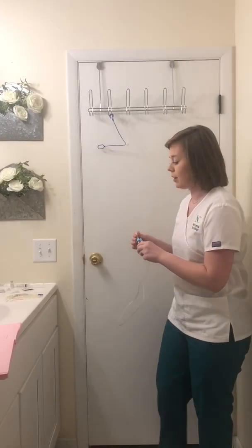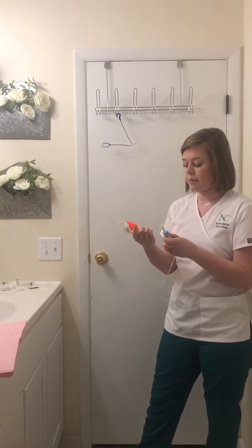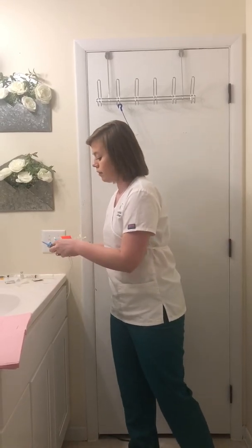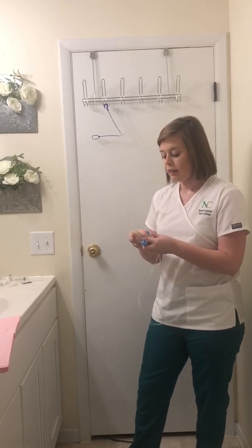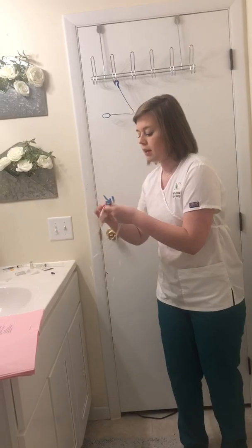And then I'm going to go ahead and spike my medication. And also before, I would want to make sure I add my label on my medication of the time that we administered it, the amount, the patient's name, the type of drug. So then I'm just going to go ahead and spike this.